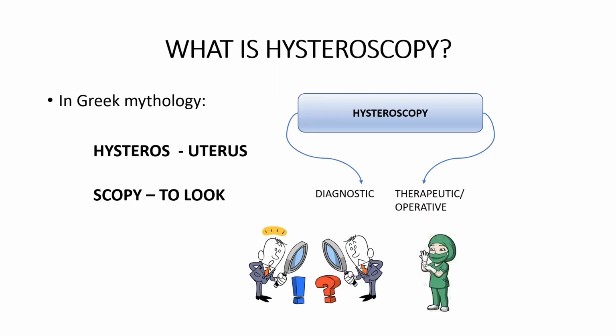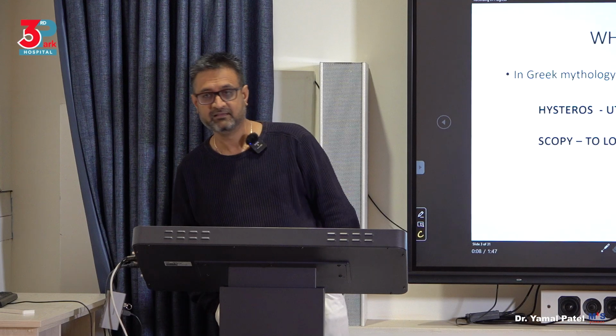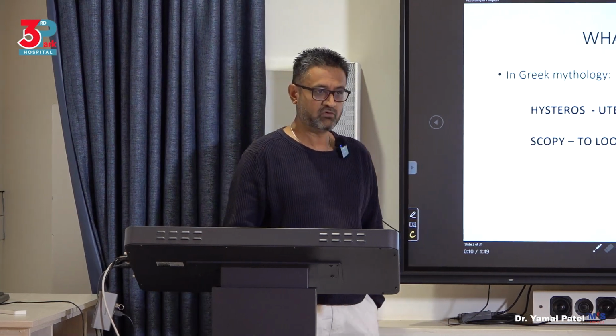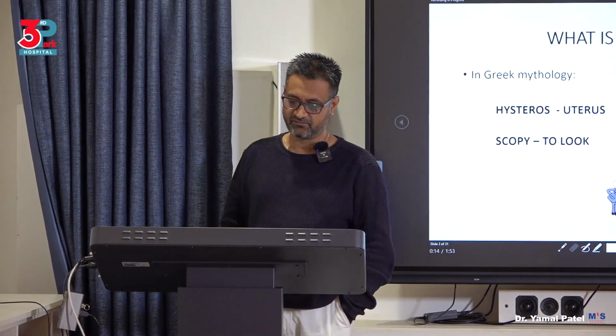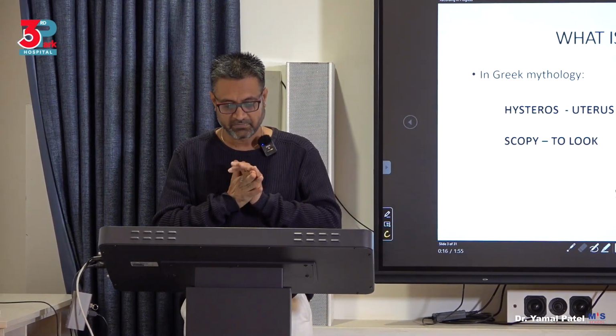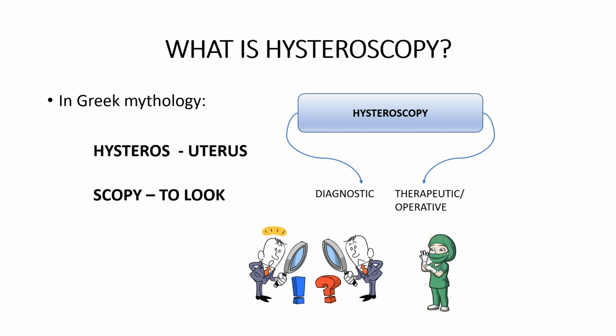So, what is hysteroscopy? Well, hysteros stands for the uterus, scopy stands for looking, and therefore it is trying to look at the uterine cavity from the inside. We have both diagnostic hysteroscopy and we have therapeutic or operative hysteroscopy.